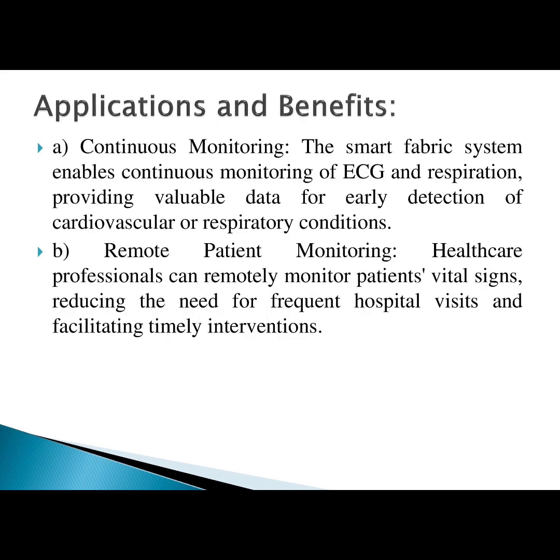So what are the applications and benefits? The first one is continuous monitoring. The smart fabric system enables continuous monitoring of ECG and respiration, providing valuable data for early detection of cardiovascular or respiratory conditions. Second one, remote patient monitoring.